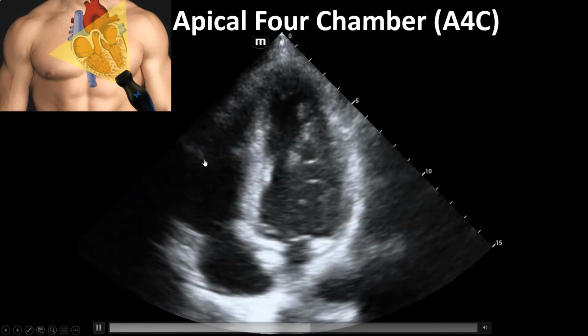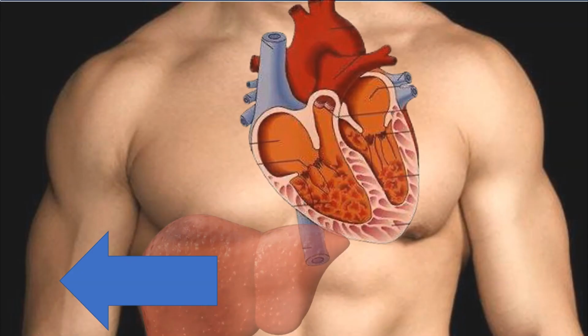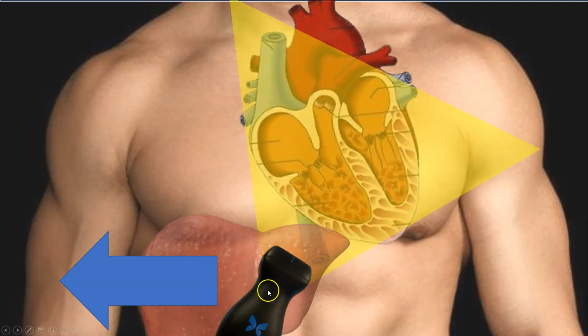Okay. The next view, after all of this, is the subxiphoid view. In this view, most useful typically for looking for a pericardial effusion, you're putting the probe underneath the xiphoid process, hence subxiphoid. The xiphoid process is at the bottom of the sternum, usually right around here. So your probe marker will end up here with the probe looking up and your probe marker to patient right. That would give you a view sort of like this, and you'd end up going through the liver to get to that view. So again, everything's going to be flipped as what you see it.